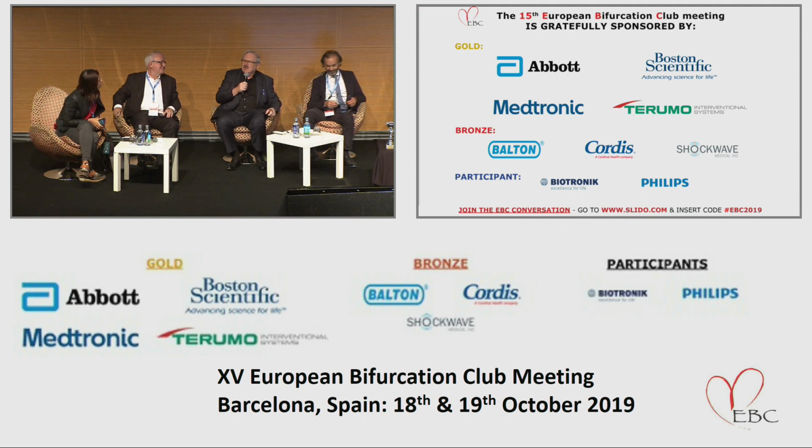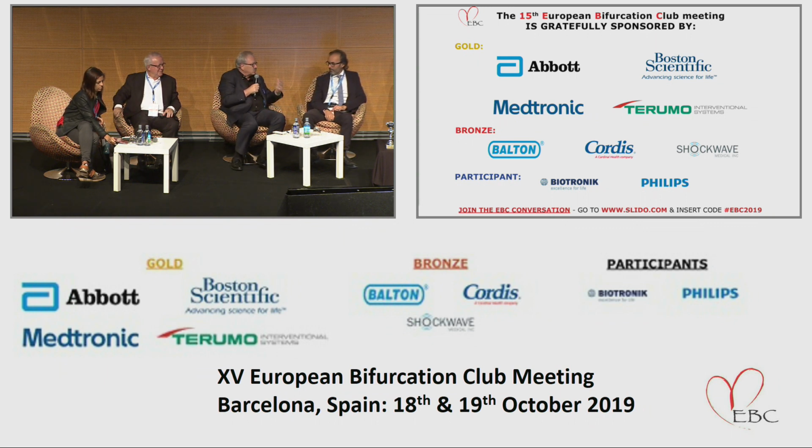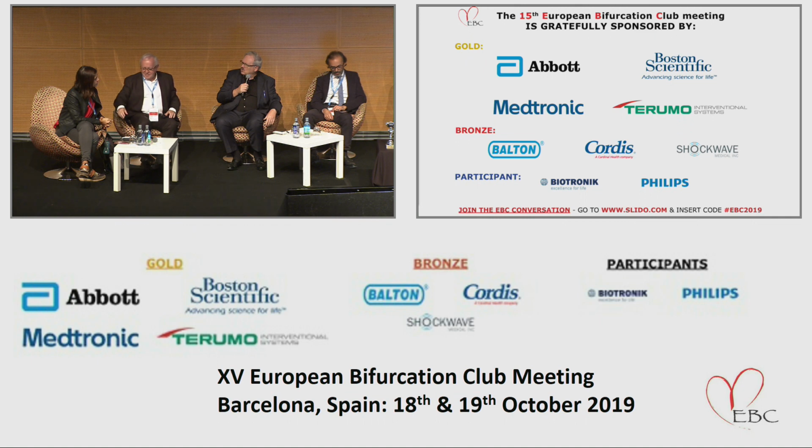But it's true that in Washington, Ron Waxman still has a very good practice with brachytherapy. These individuals have had one stent, two stents, the third stent in the same place. Yes, brachytherapy will remain a solution for them. And he's doing a little bit less than 100 patients a year, I think, because they come from everywhere in the United States to have brachytherapy, because the system is working, there is maintenance, et cetera, et cetera.